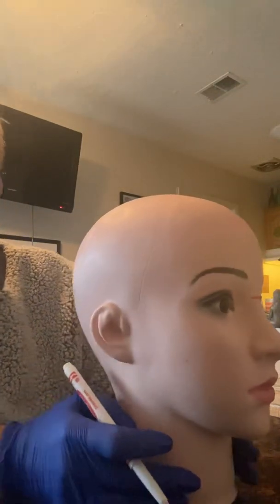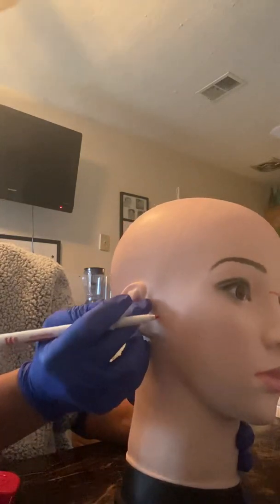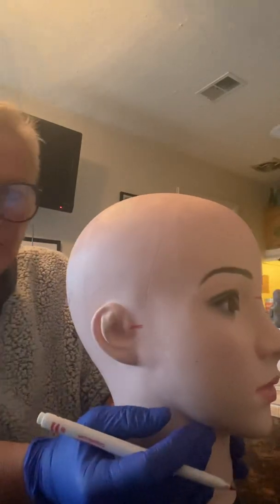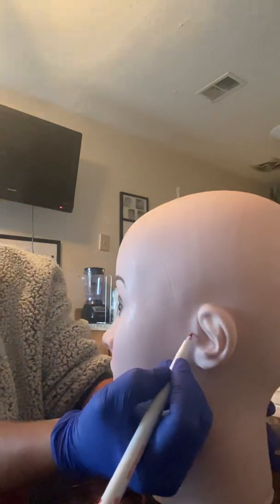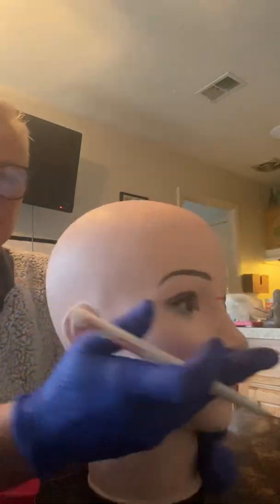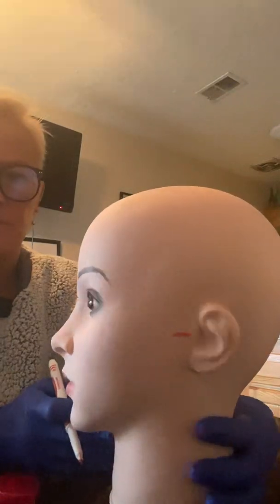The preauricular points are just anterior to the tragus, the little protrusion in front of the ear. Here is the right preauricular and here is the left preauricular. So we have the four: nasion, inion, right and left preauricular.